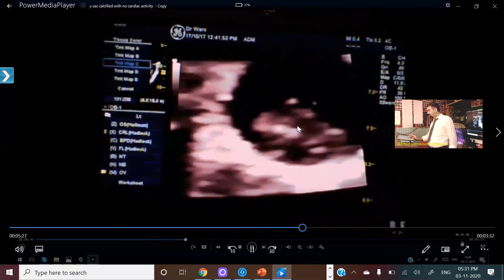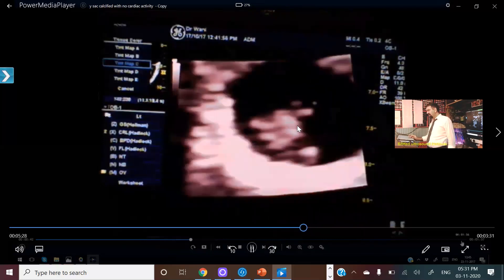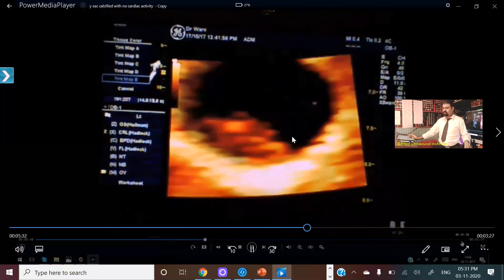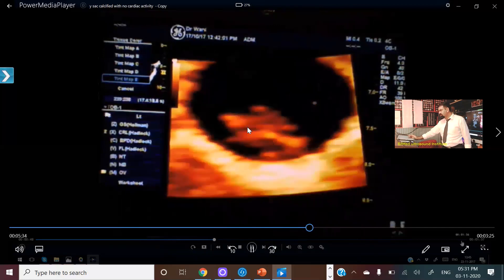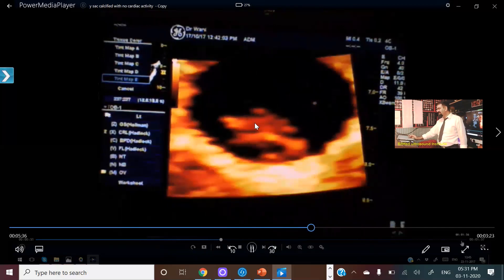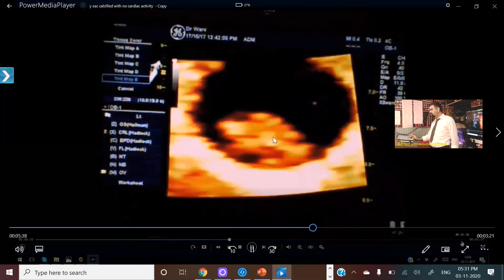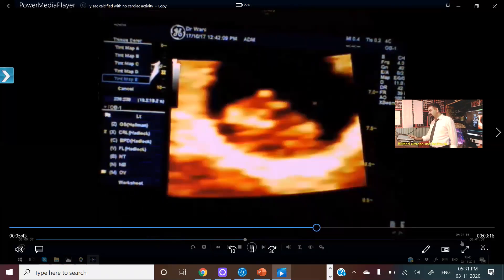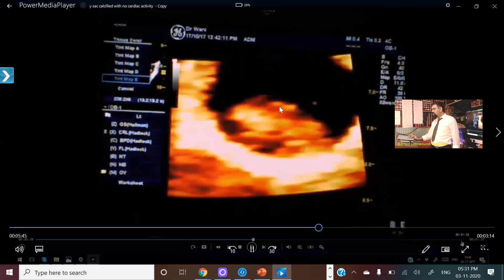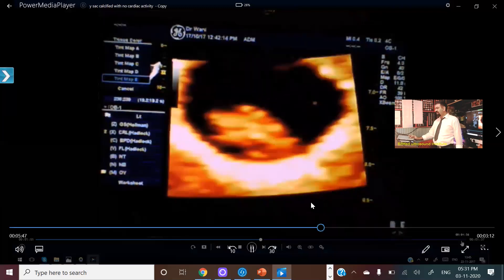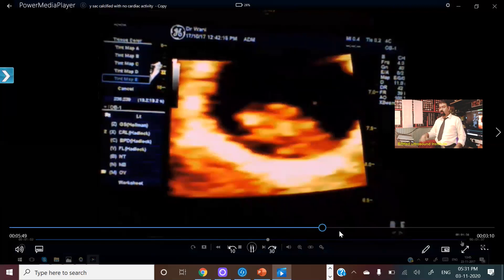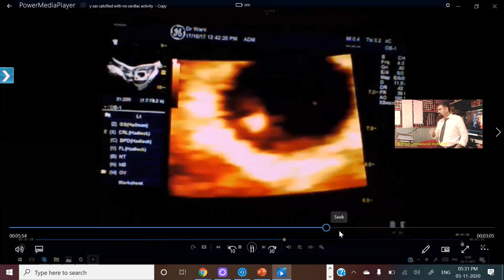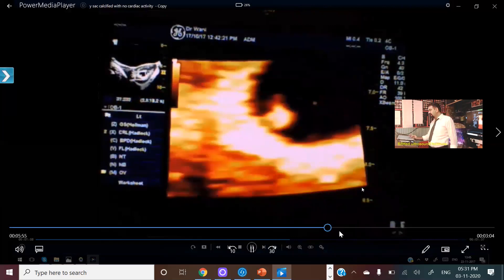Pay attention — this is a transabdominal scan, not a transvaginal scan. This is the fetal pole over here, and I am not able to see the fetal pulsations. So what I have to do is look for the yolk sac. In this plane I am not getting the yolk sac — I am searching for the yolk sac. If I will not get any yolk sac, it means I am dealing with a dead fetus already.